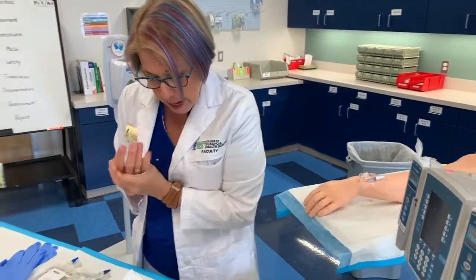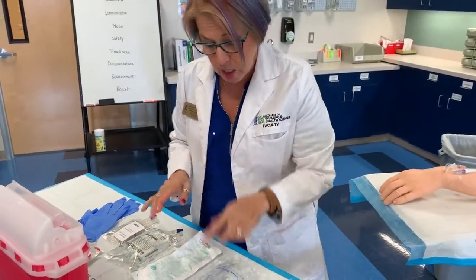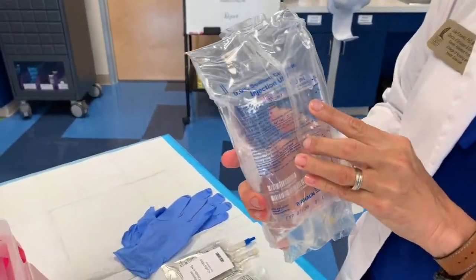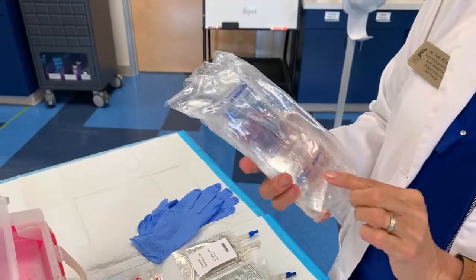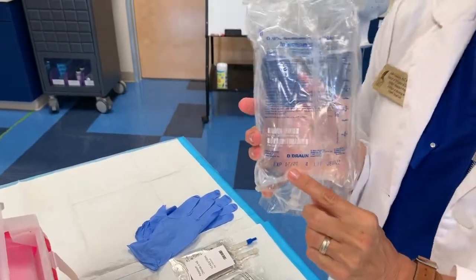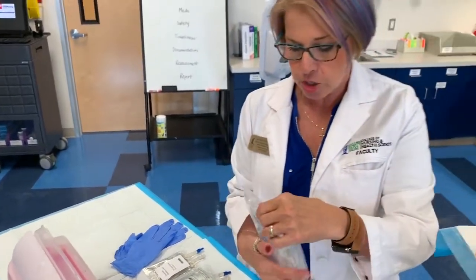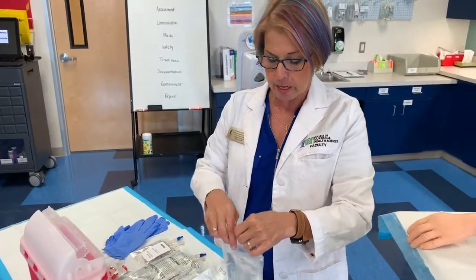When I look at my bag of IV fluids, one of the things I want to look at is, is it the right solution? And so I can see here, we've got 0.9% normal saline, and I want to look for the expiration date. And so this bag expires in July of 2020. And so you want to make sure you do review your expiration date and make sure you're not hanging fluids that are out of date.